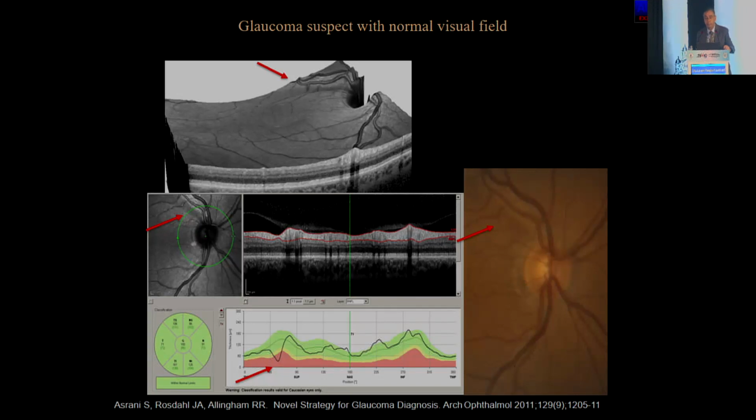And the best value you realize of the OCT is when in the morning your staff tells you that the OCT machine is not working. That's when you start getting panicky. How are you going to go through your day? We are so dependent on the OCT machine. But there are some clinical skills that come to save the day.